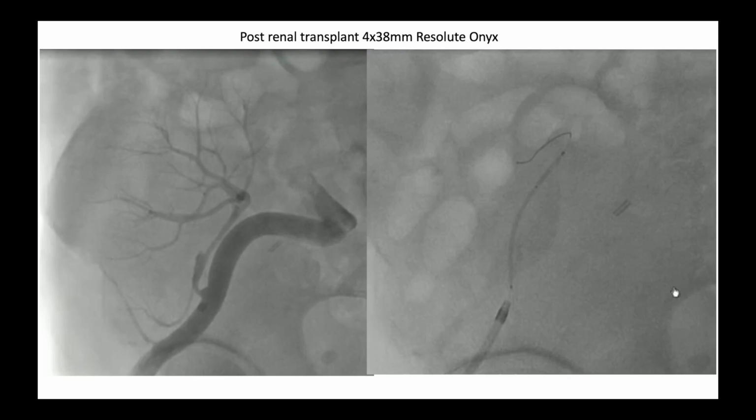So, in this patient, what we did was we deployed a 4 by 38 millimeter Resolute Onyx stent, and now you can see this is the final result.